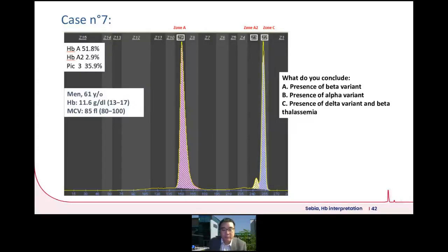So how about this case? You see a major peak in hemoglobin in zone C, and hemoglobin A2 percentage is within the reference range. So major splitting, it's most likely the presence of a beta variant.